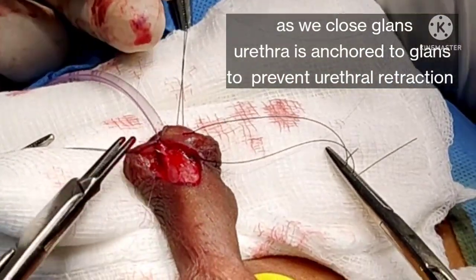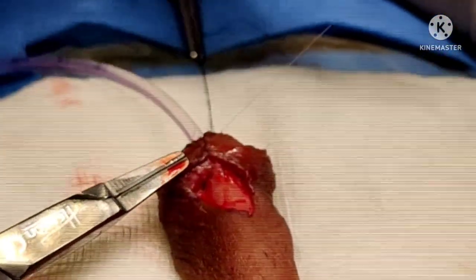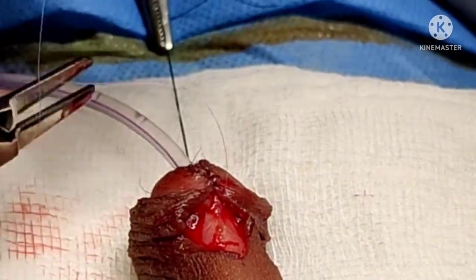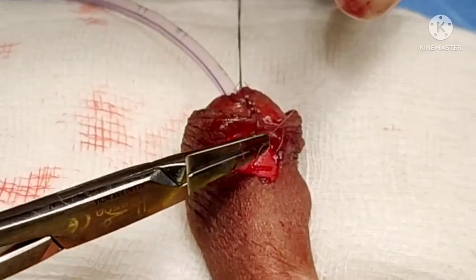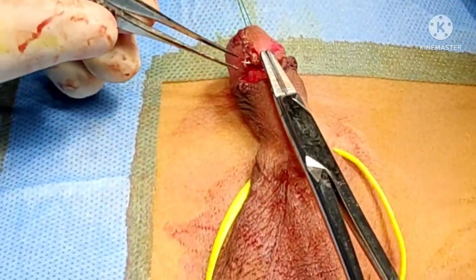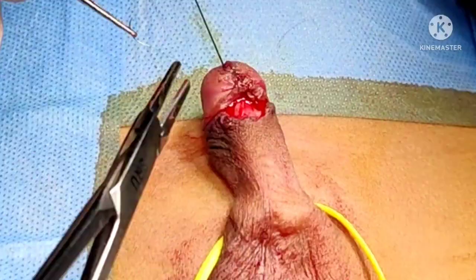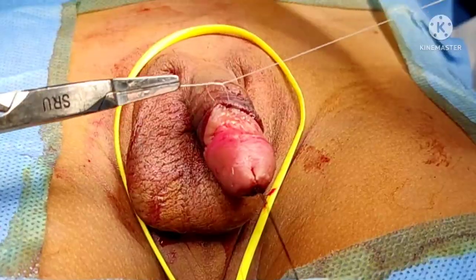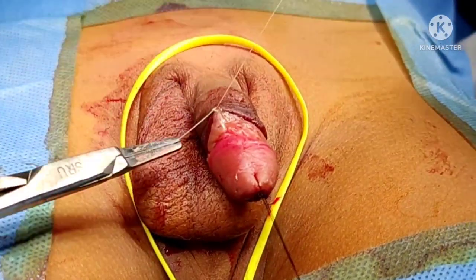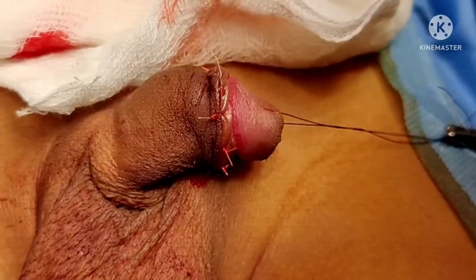The glans urethral disassembly enables the urethra to be placed very distally and also achieves a good glans closure further below the meatus. The glans closure and the frenular collar closure is done using 7-0 PDS, and we now do the excess foreskin removal. The circumcision is completed by anastomosing the foreskin to the remaining penile skin.